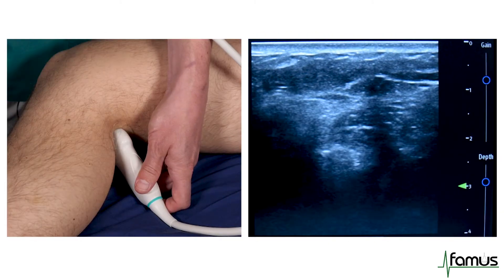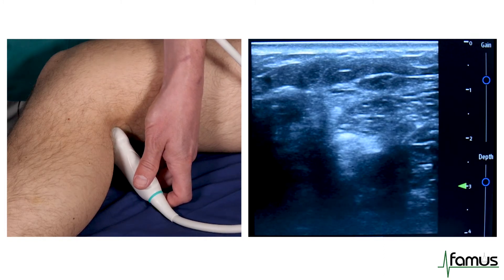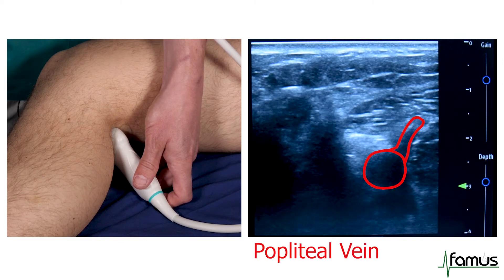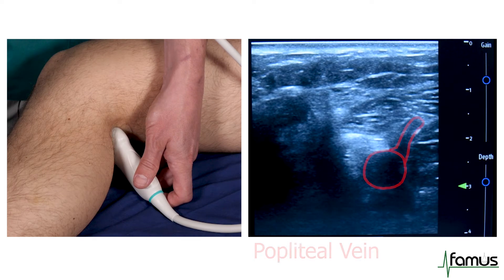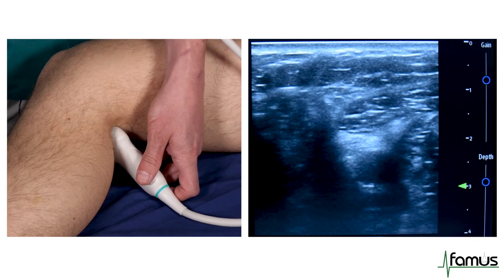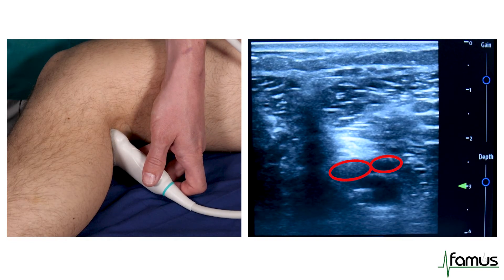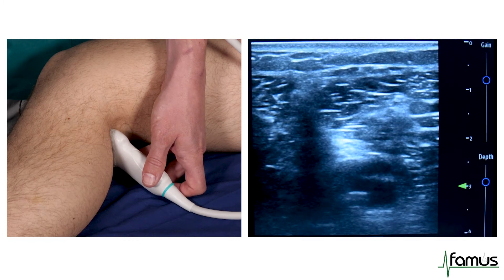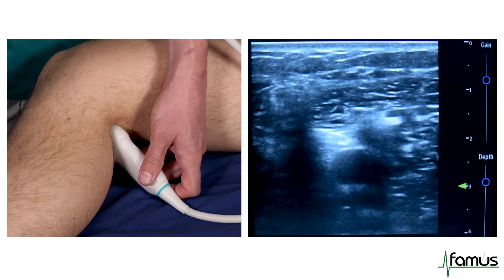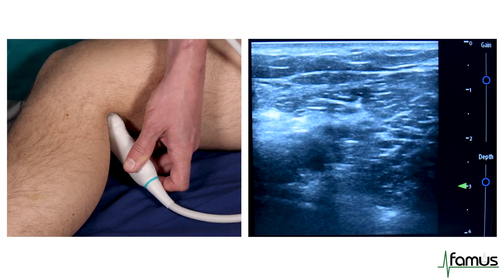The third point of the examination is in the popliteal crease, and the orientation of the probe here is slightly less important, but we're trying to identify the popliteal vein. In this image, we can see the first branch of the popliteal vein. As I tilt the probe slightly more distal, we can see the popliteal vein branch into two. I then tilt the probe back slightly more proximal to identify the popliteal vein and apply some pressure, and we'll see the vein fully collapse with the pulsatile artery still visible below it.